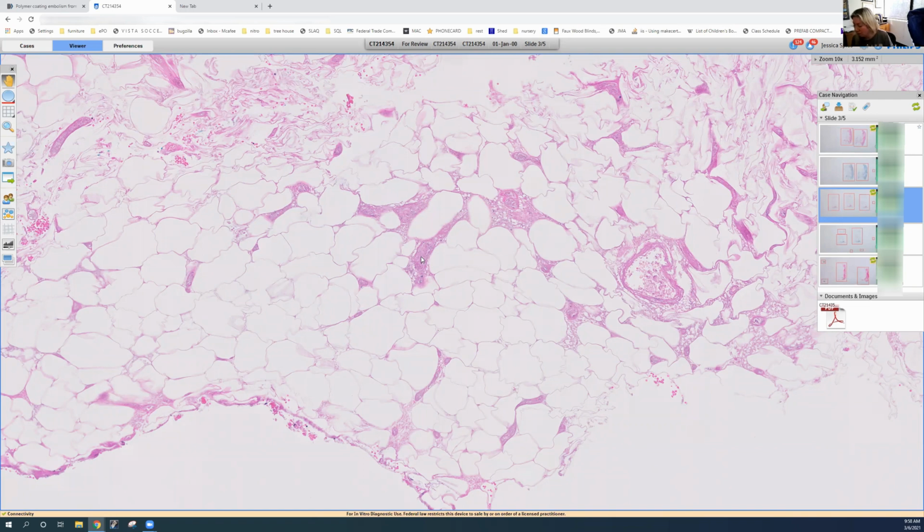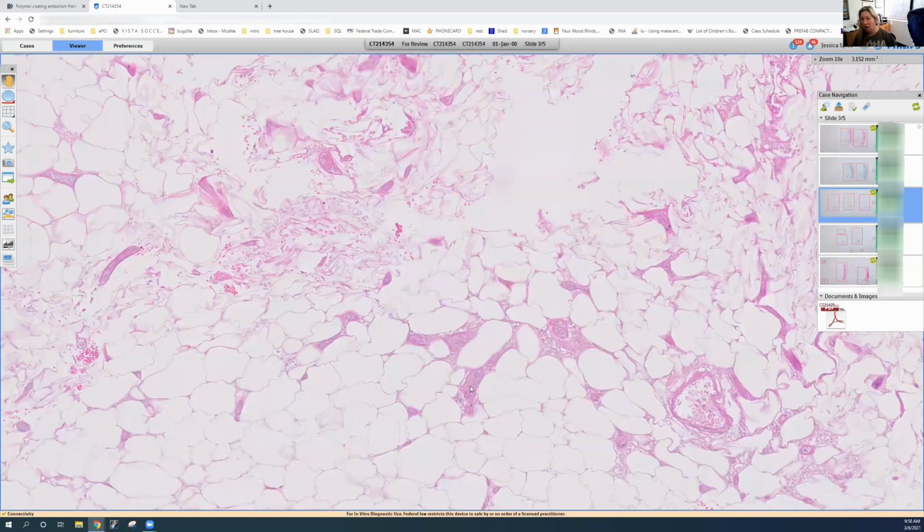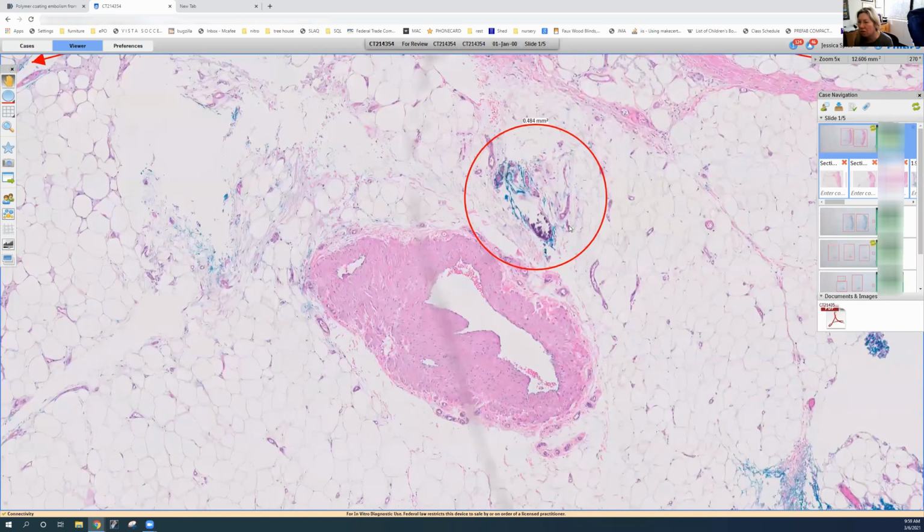It's in the usual clinical setting for it. It can be very difficult to diagnose histologically. First of all, there's sampling error. You have to get quite a bit of subcutaneous fat, which is where the pathology is going to be. And there is a paper written by Jeff North at UCSF a few years ago describing the use of von Kossa calcium stain, looking for the calcifications because they can be quite fine in vessel walls, not coarse, as we saw in this case where they were more obvious. You can see them at low power even. And that can be really useful in subtle cases to use the von Kossa stain.